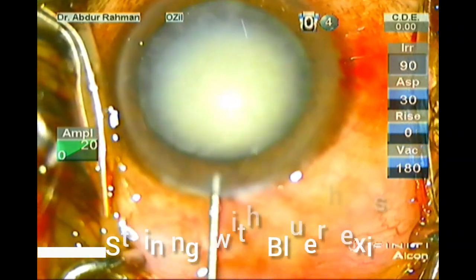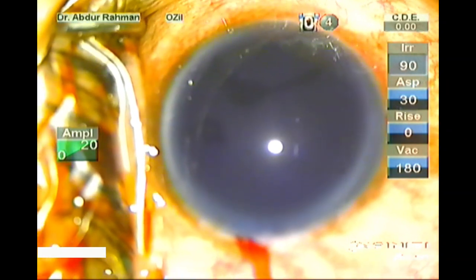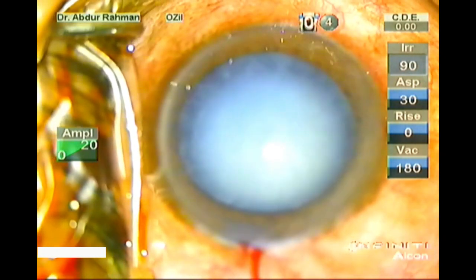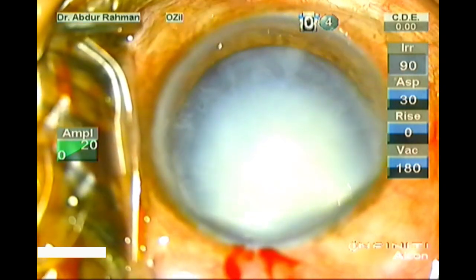I have already made the side port and main port. Now I am staining the anterior capsule with blue rex. Wash out the blue rex with BSS. Now fill the anterior chamber with OVD.